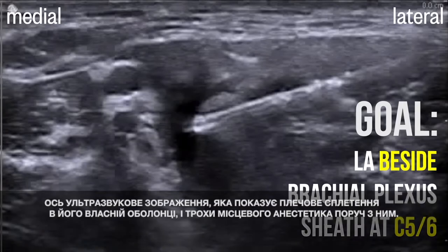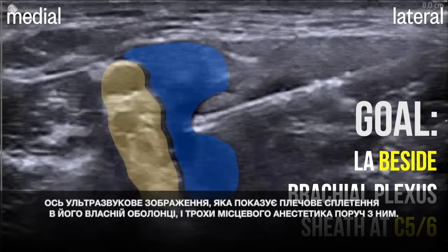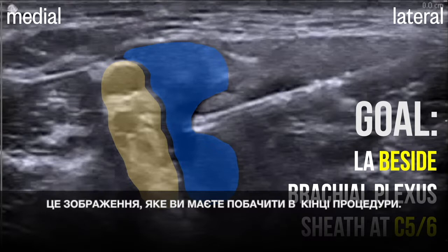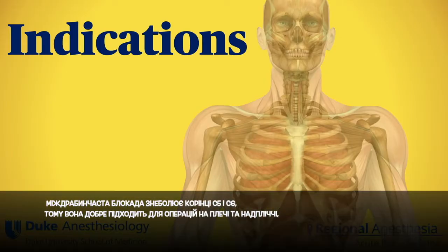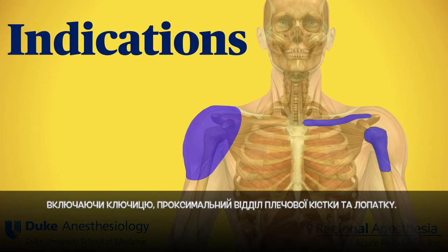Here's an ultrasound image showing the brachial plexus contained within its sheath and a puddle of local anesthetic right beside it — this is the image you're aiming for at the end of the procedure. The interscalene block anesthetizes the C5 and C6 roots, so it is well suited to procedures of the shoulder and upper arm, including the clavicle, the proximal humerus, and the scapula.